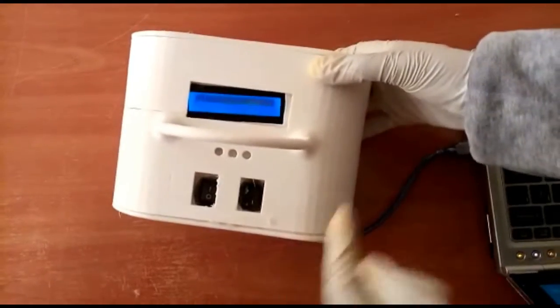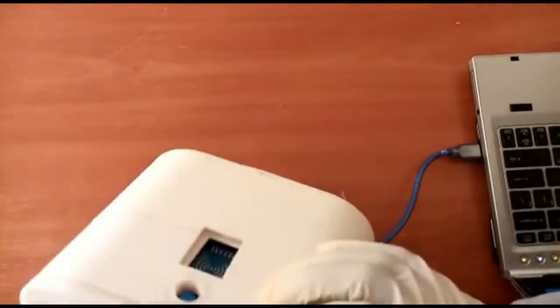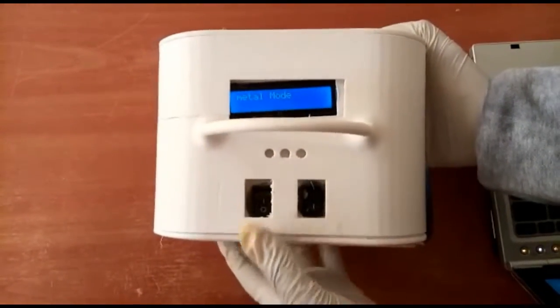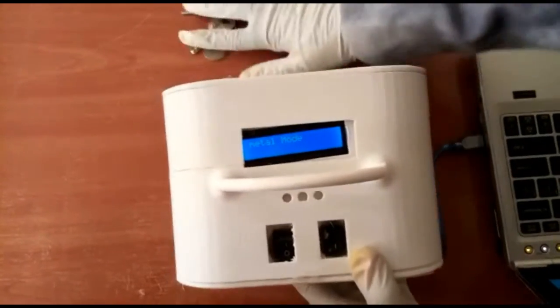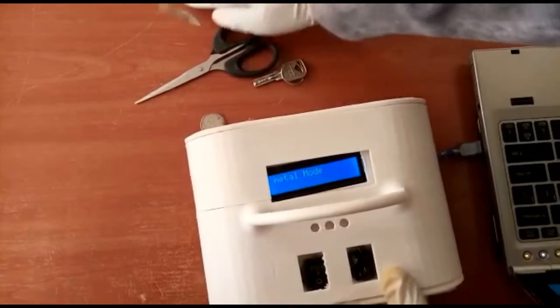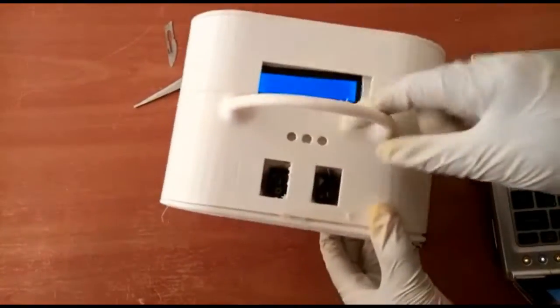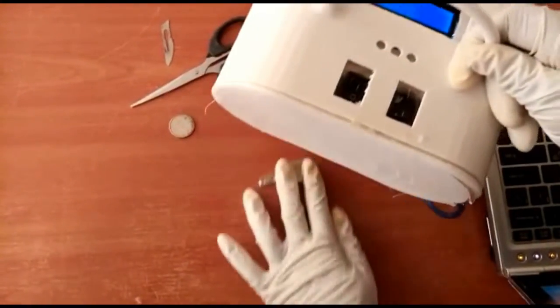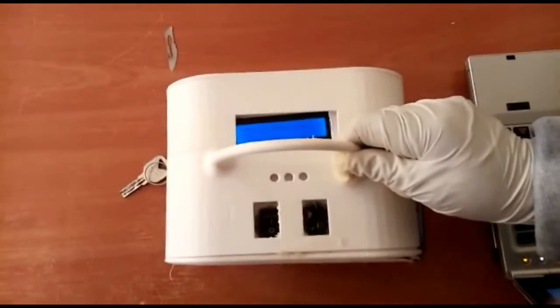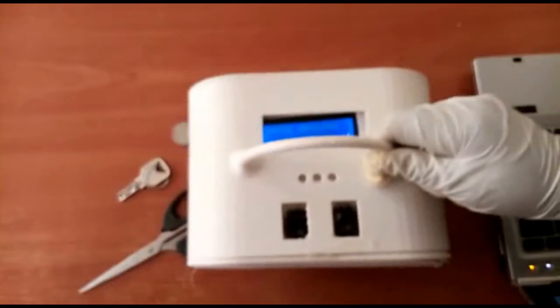Metal detection mode: LCD buttons, LED output, metal detector, RFID scanner. I'll turn on the metal detection mode and I'll scan these metals here. To demonstrate, I'll use the metals which are available. I'll start with the coin, and as you can see, it has shown the light. Even the key, there is a red light to indicate metal has been detected. LCD also prints metal detected with the scissor, and now with the scalpel.